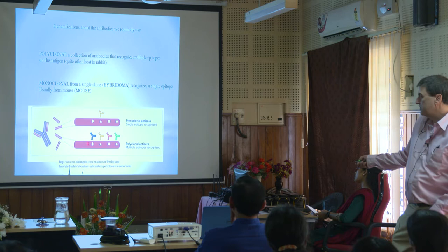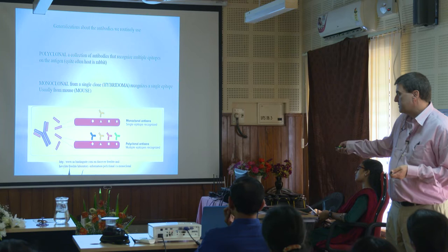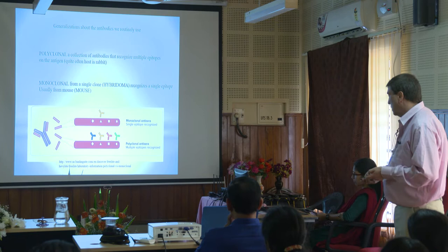Does that make sense, what I'm saying? Does everybody get that concept? Because it recognizes multiple places, chances are when you go to a different species, you have a better chance of recognizing it with the polyclonal than with a monoclonal. I'm not saying a monoclonal won't work, but chances are you might have better success with the polyclonal. Okay. So this is just a brief comparison between polyclonal and monoclonal. Okay.